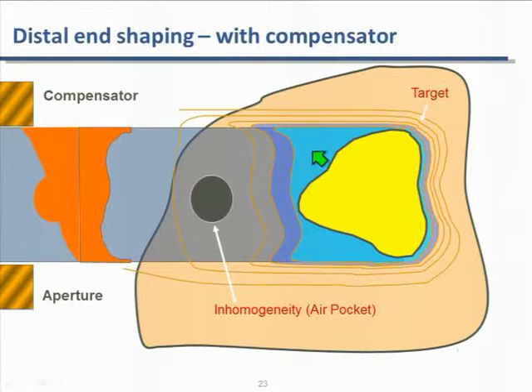So if you measure any 2 points from here to here, anywhere, it's a fixed value. So when you modulate around the target like that, you have this extra dose you cannot do anything about. But arguably, with pencil beam, you can have better or less contribution in this area.